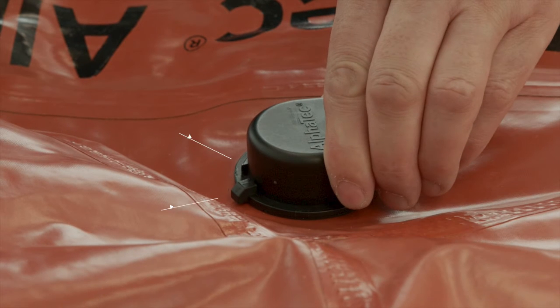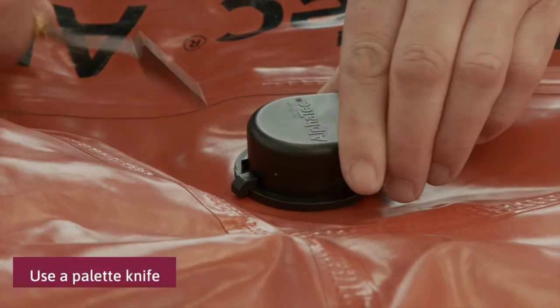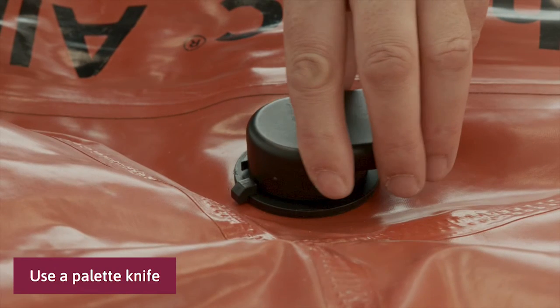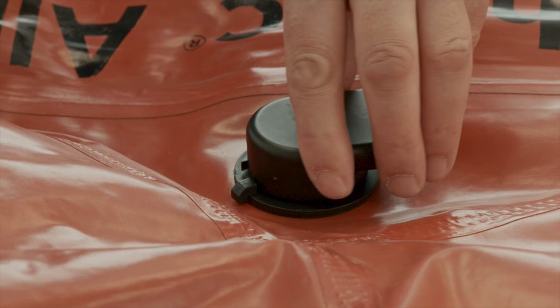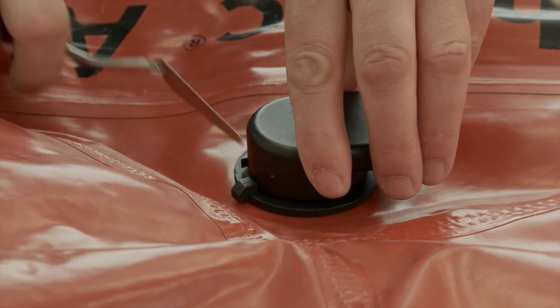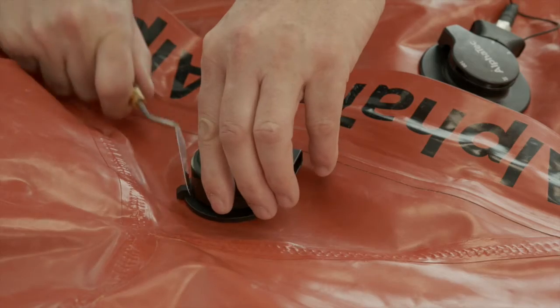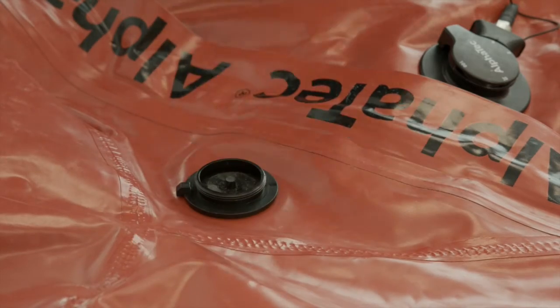Rotate the cover clockwise so the cover lug is 6 to 8 millimeters past the valve body stop. Carefully insert a pallet knife between the cover lug and the body stop — do not use a knife. Do not try to lever the lug and valve body stop apart, as this could damage the exhaust valve. Slowly turn the valve cover anti-clockwise over the blade; this allows the cover lug to move past the body stop. Repeat this action until the valve cover is unscrewed from the valve body.